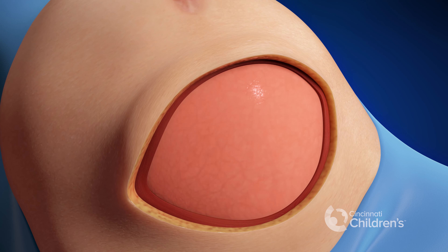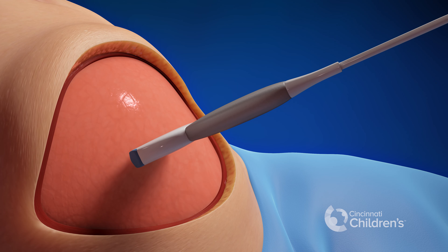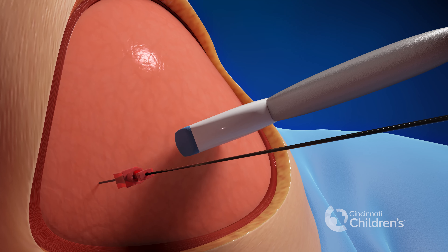After we make the incision and cut through the layer of muscle, the wound is exposed. Ultrasound helps us to confirm the position of the fetus and shows us the best location to place the first port for the surgery.